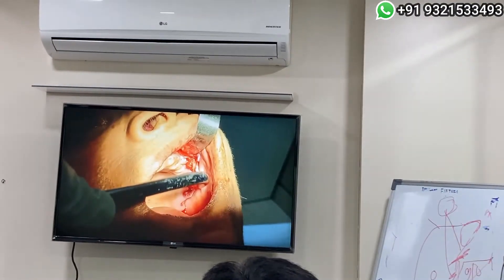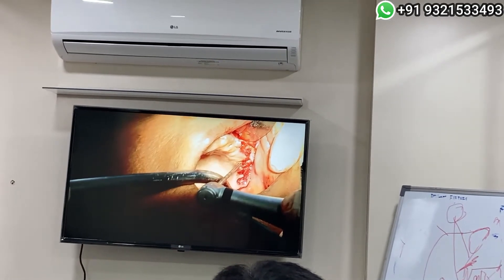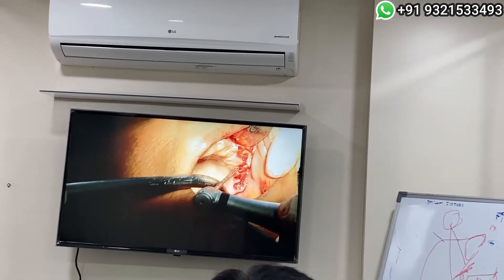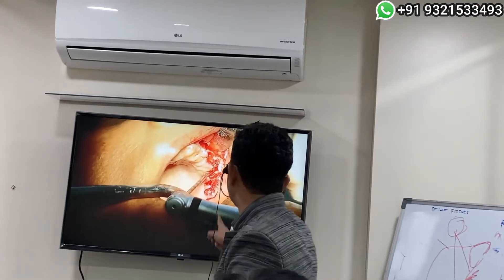The drill was deepened and now you can see the position of this drill. Earlier the drill was somewhere here like this — now it has come correct.